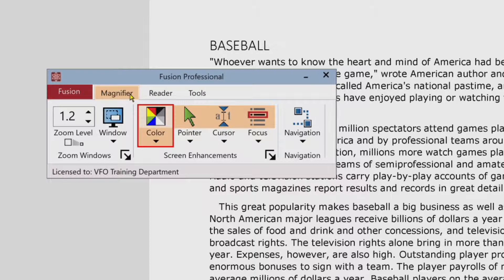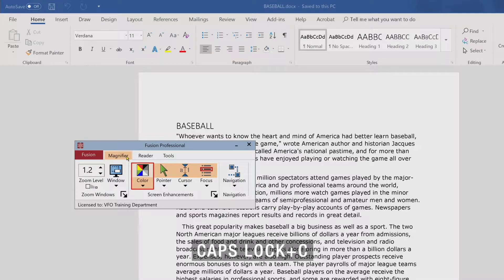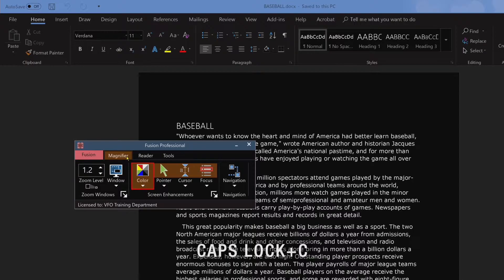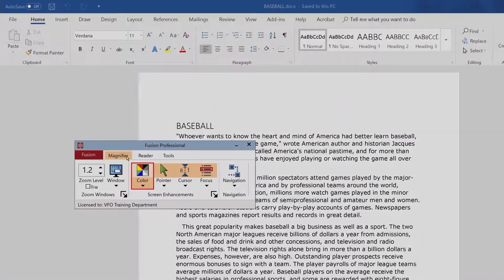Magnifier, text. Or, press the color enhancements toggle keystroke, caps lock C. Color enhancements enabled, checked. Color enhancements disabled.